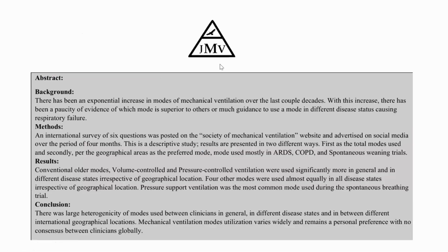Okay. So which mode of mechanical ventilation we need to use all depends on clinical experience and our protocol, so don't sweat about it in general. You can use any mode. What matters is which specific disease might need a specific mode of ventilation. For example, you can use volume control for patients with asthma or ARDS, but it doesn't mean it always has to be. Especially for ARDS, you can use lung protective ventilation, so make sure that the tidal volume is kept at the lung protective strategy of 6 to 8 ml per kilo. So you can calculate the pressure that can give that same amount of tidal volume.